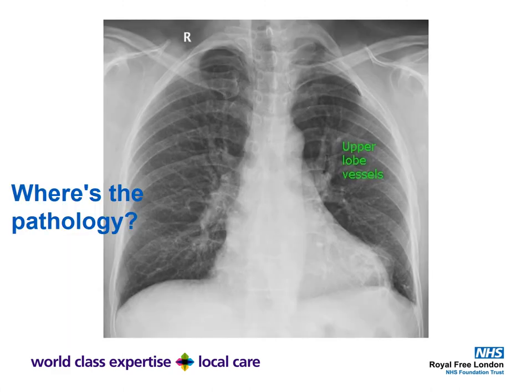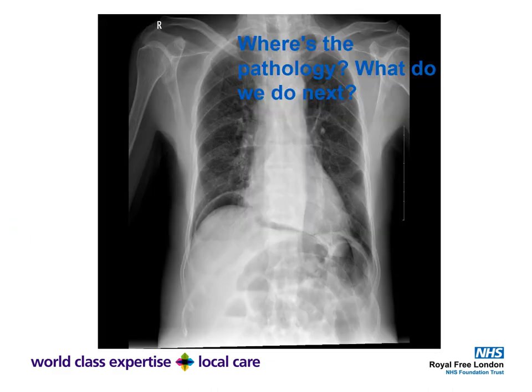Where's the pathology? The upper lobe vessels are quite prominent and the pulmonary vessels are bulky. It's important to appreciate that some apparent nodules on a chest X-ray are actually vessels coming toward you in that plane — the chest X-ray is one projection whereas the lungs work three-dimensionally. So where is the pathology and what do we need to do next?